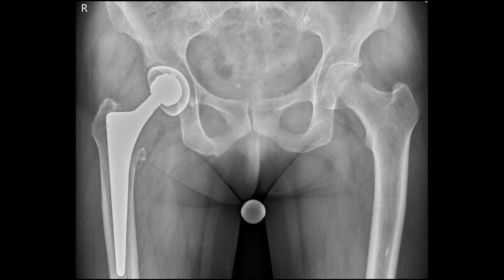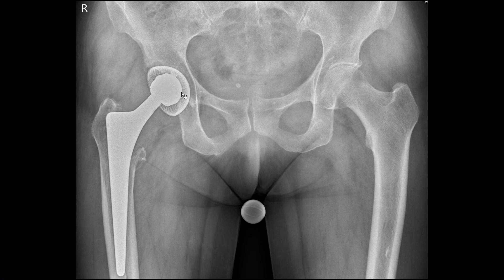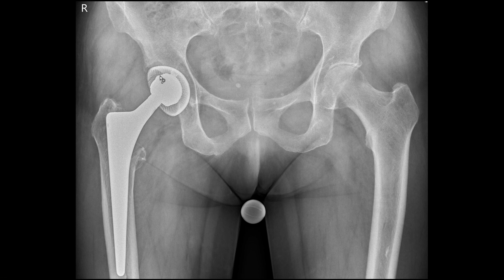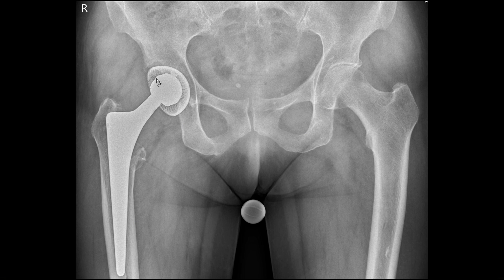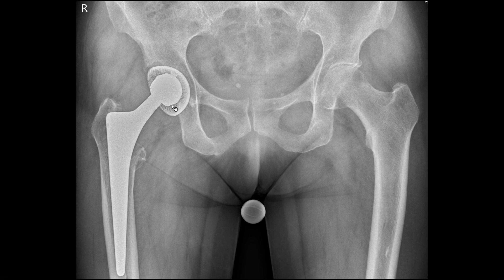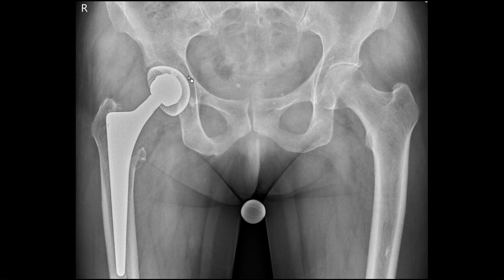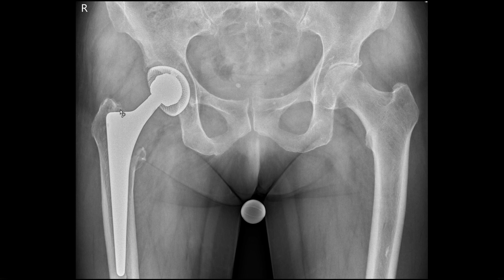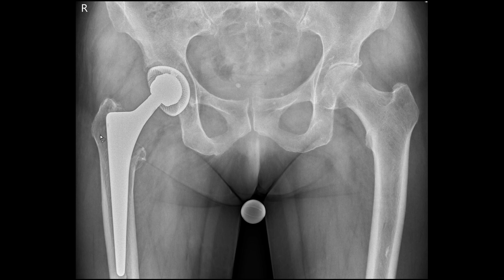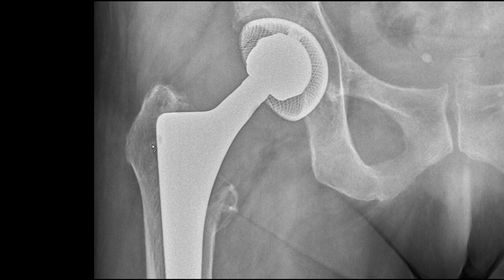So this is our first case and you can see we have a hip arthroplasty on the right hand side which is a metal-on-metal device. You can see there is a metal cup inside the other metal cup and the femoral head, which is also made of metal, is articulating with this metal cup. If you look carefully you can see there is some osteolysis here, and maybe even around the shoulder of the femoral stem there is some osteolysis here.